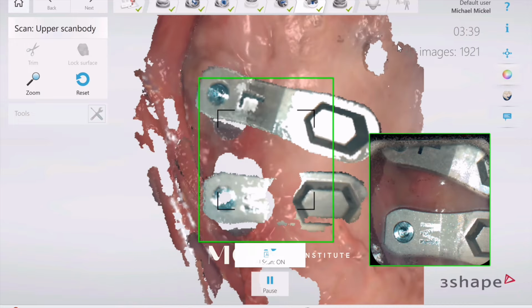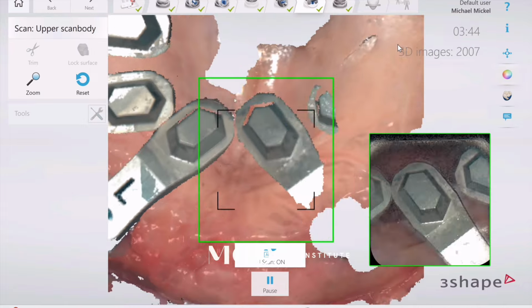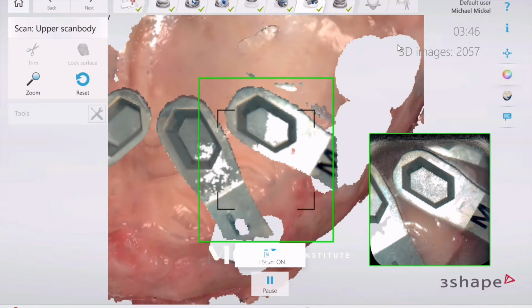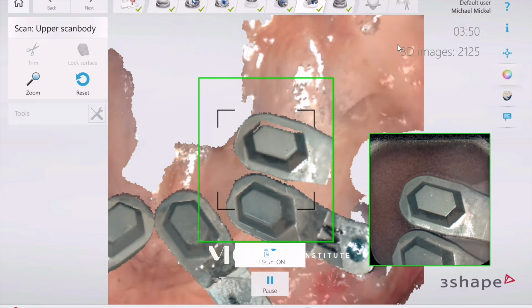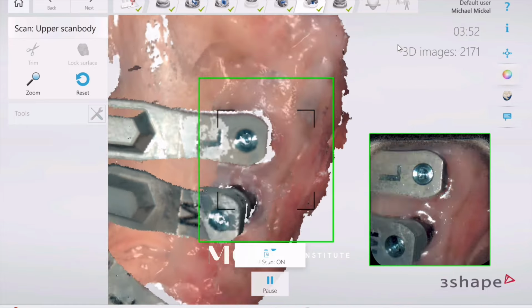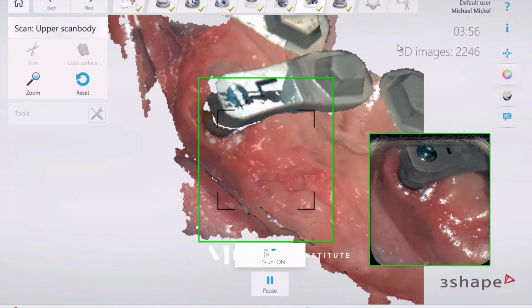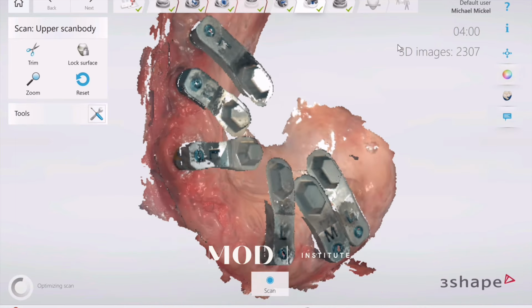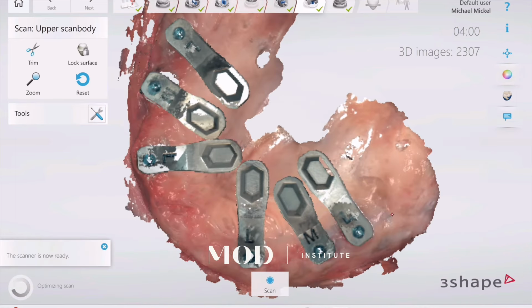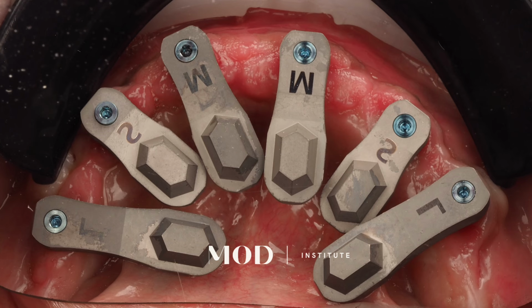Now, one thing I will say is this is my first time using these. And you really don't need to get where they attach to the tissue, to the implant. You just need to scan the center. You actually don't need any of that other information. In fact, it's more accurate just to focus on the hexagons. So all of this extraneous stuff that I'm scanning right now is unneeded here. Literally just scan the hexagons because they don't even need to be correlated to the arch at all. They don't need to be aligned to the arch.